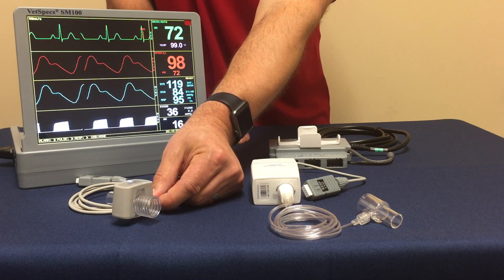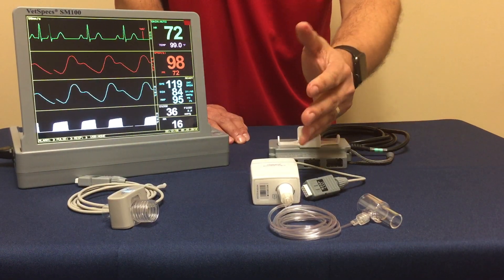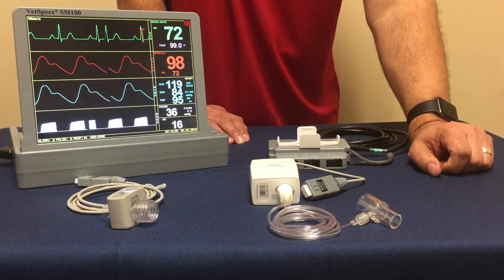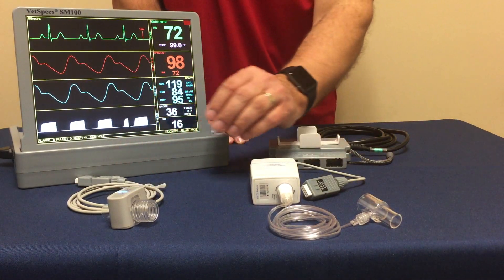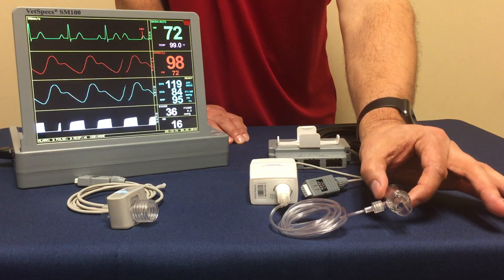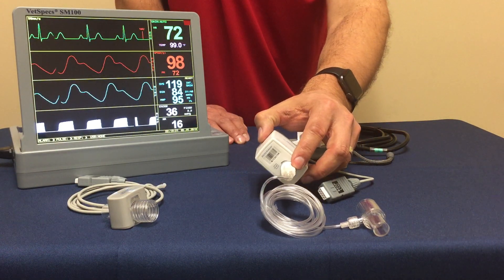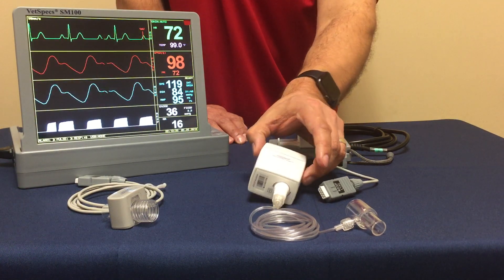Mainstream is for surgical. As we go to the microflow sidestream option, this can be utilized both in dentistry and surgically with equal performance. A little more involvement than the mainstream sensor as far as hookup. Essentially, you're going to have an airway adapter which connects to the trach tube. There is a six-foot sample line, a filter involved to filter out moisture, and the sensor and module.